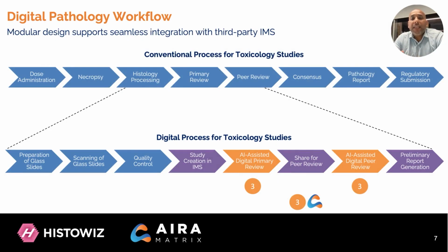Traditionally, toxicology study assessments have been highly manual, requiring extensive time and effort from pathologists to analyze slides, document findings, and conduct peer reviews. This process is not only time consuming but also prone to variability and human subjectivity. With digital pathology, we introduce AI assisted automation, significantly reducing the turnaround time while improving consistency and objectivity in assessments. AI models are designed so that they can rapidly screen and analyze large volumes of whole slide images, flagging potential abnormalities for further review by expert pathologists, and enabling the pathologist to focus on complex cases.